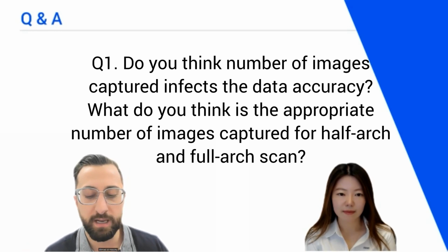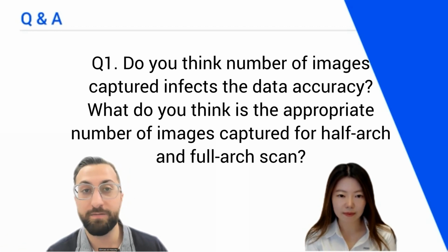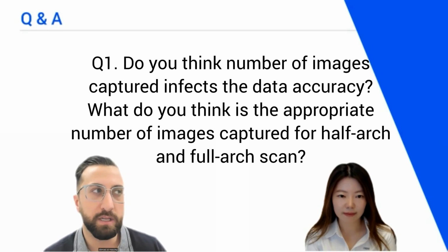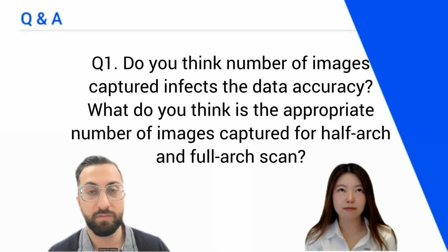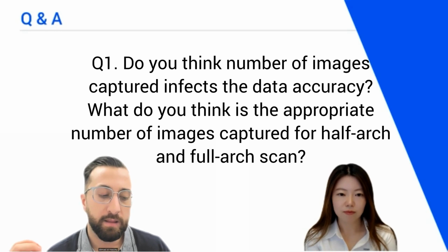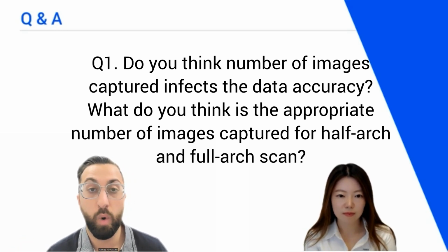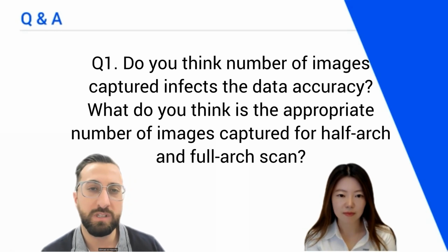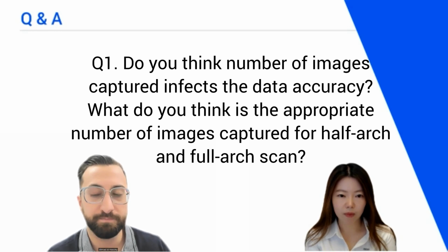For a full arch scan, I think if you're a beginner, 2 to 3 minutes is fine, 4 minutes even. But once you get experience, genuinely, you should be able to routinely do a full arch scan within 60 seconds, routinely. And the longer you take and the larger the quantity of scan images, the issue is you're making the file quite large, which makes it quite annoying to save on the cloud and upload. So there's many reasons why you should try to be more efficient.